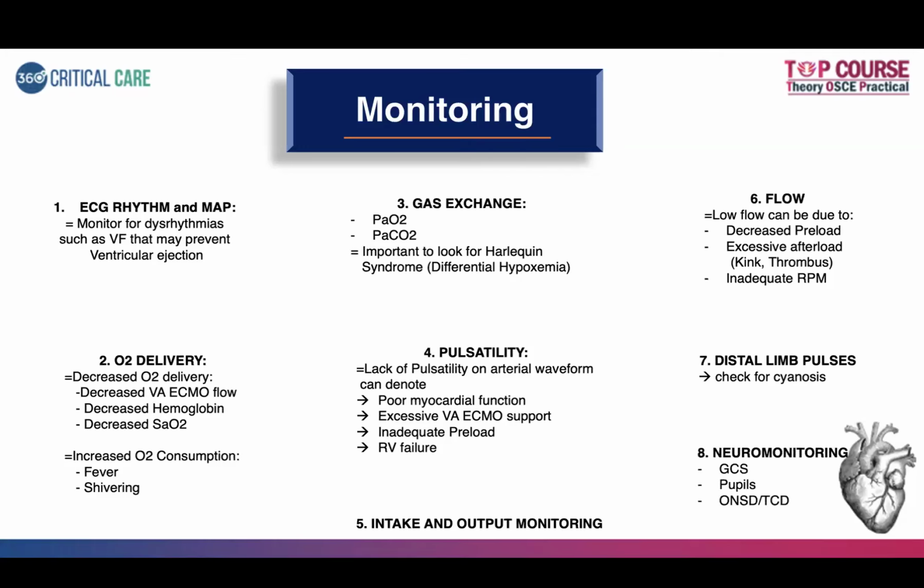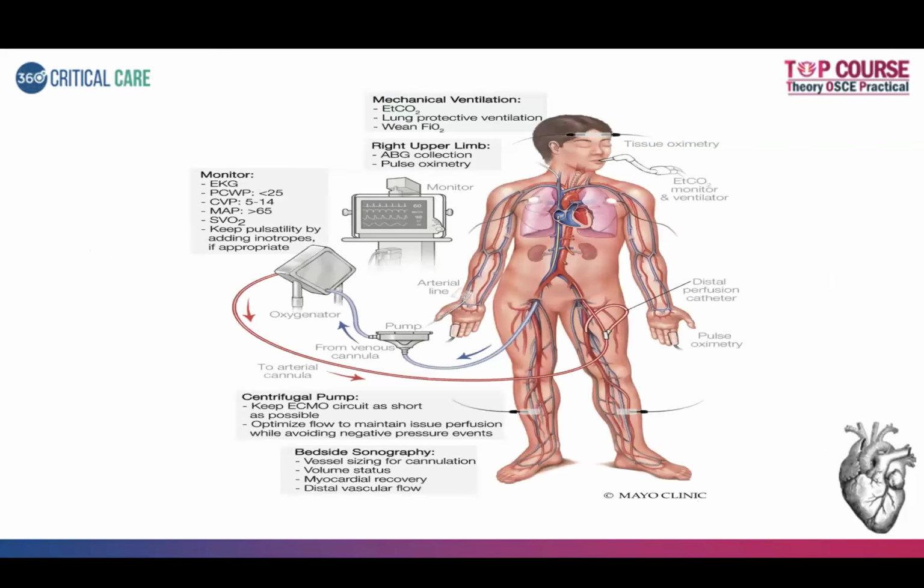And neuromonitoring in the form of GCS, pupils, or non-invasive ICP monitoring like ONSD or transcranial Doppler can also be done. So this is just a summary of what I had told. Since in the previous one I had made small animations, this will help you in writing. If a question is asked related to monitoring and ECMO, I think this diagram will give you an overview so that it will be easy to answer. It's almost similar to everything that I covered in the previous slide.